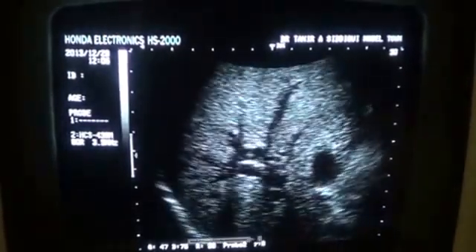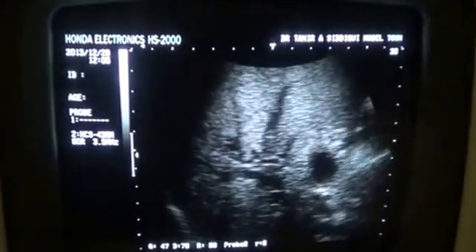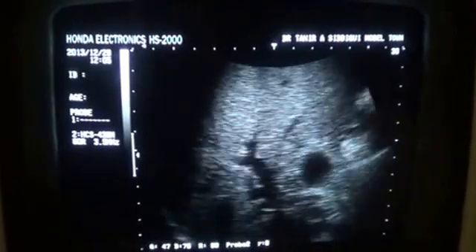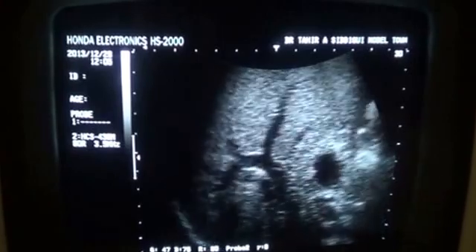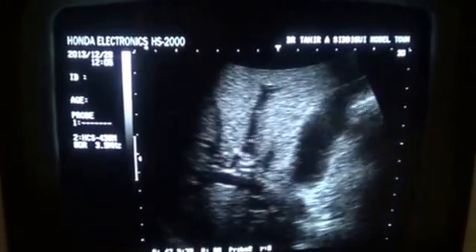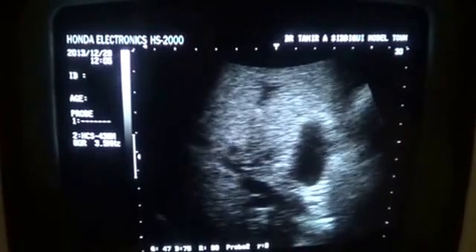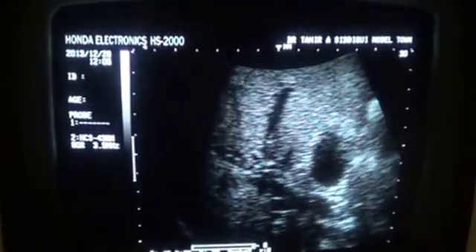And here are the dilated ducts. This is the magnified view. Otherwise the pancreas is normal, there is no other pathology seen. Thank you very much.